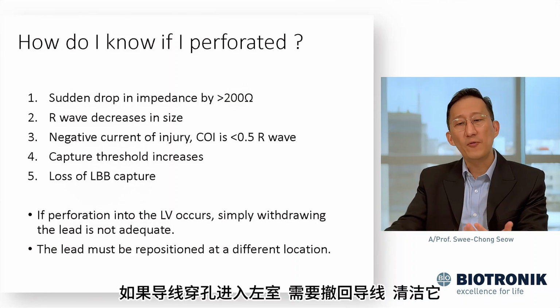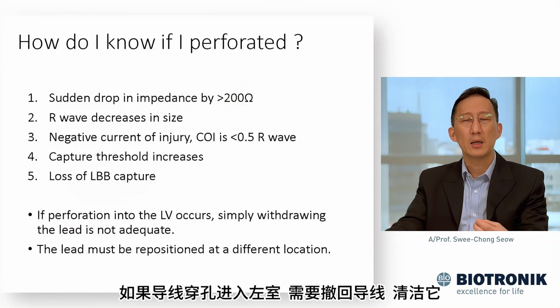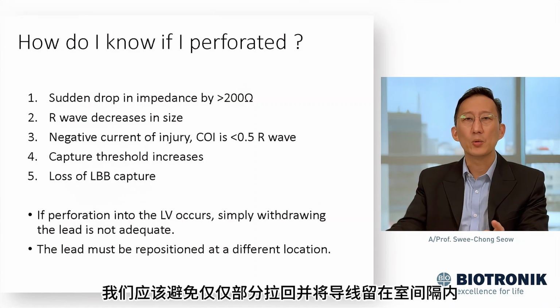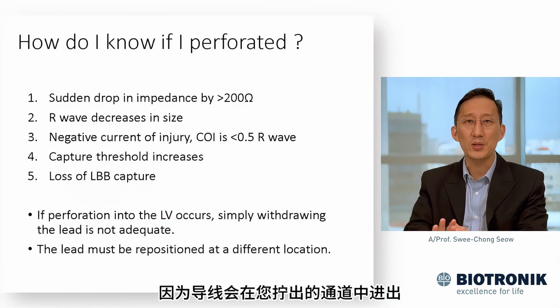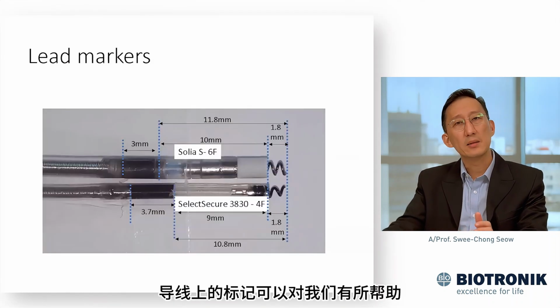So if perforation occurs into the LV cavity, all that needs to be done is to withdraw the lead, clean it, go to a different spot, and go again. So we would want to avoid the temptation to just pull back partially and leave it in the middle of the septum, hoping that it will stay there. That's not going to happen, because the lead will just move in and out of the channel that we've created. So the markers on the leads help us.